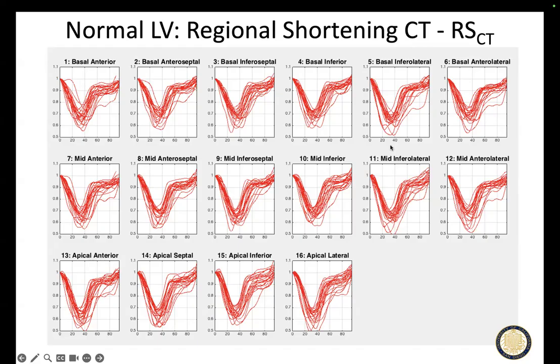resolution at 16 segments around the heart. You can do it with higher resolution, actually. We can go up, my guess is about 48 independent segments. After you get past 48, things start to be correlated with their neighbors, but I would say about 48.